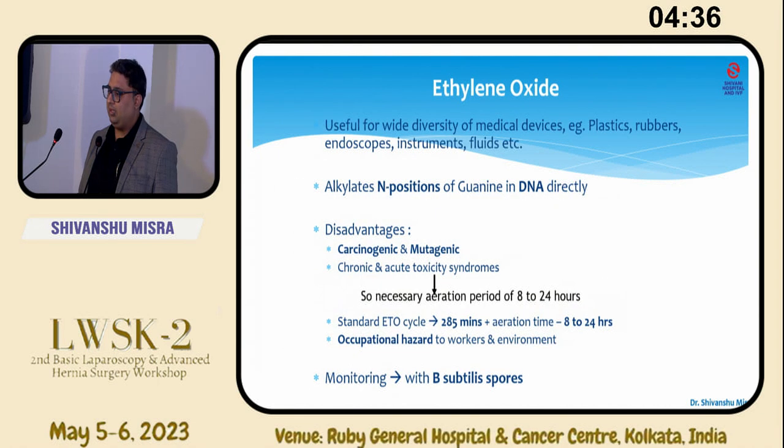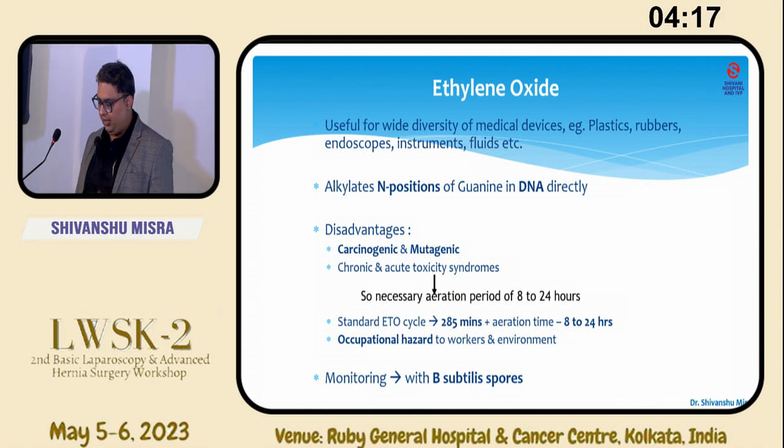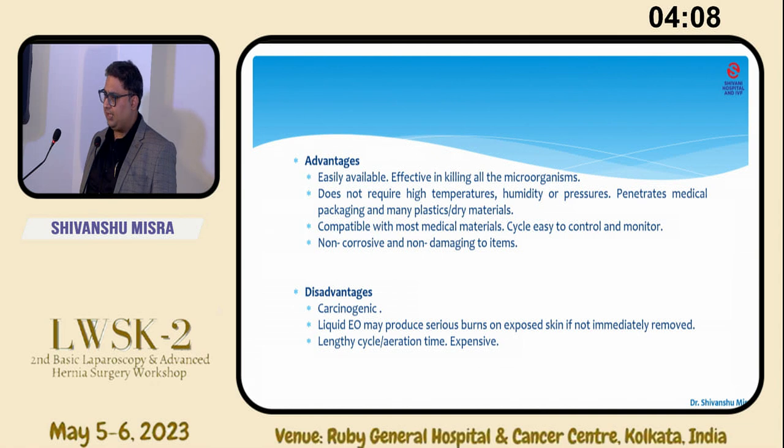The mechanism of action is that it directly attacks the DNA, going to the N7 position of the guanine, and it is carcinogenic and mutagenic, with some professional hazards associated with it. That is why a good amount of aeration time is required when we use ETO, ranging from around 8 to 24 hours. And it is easily available.